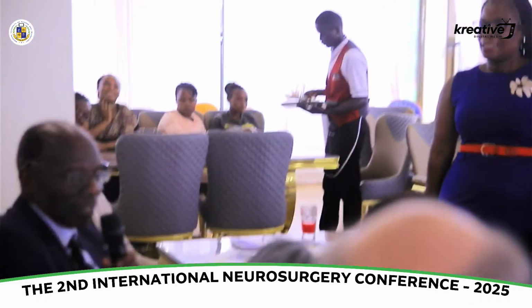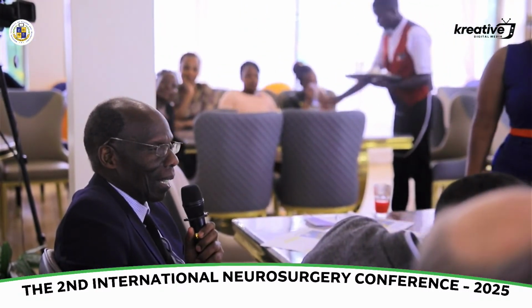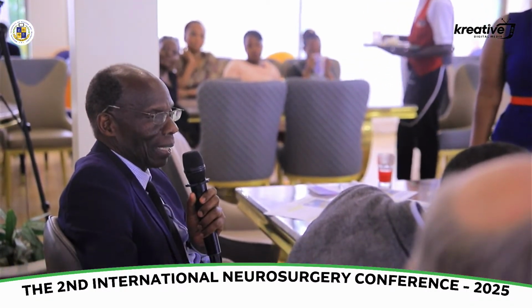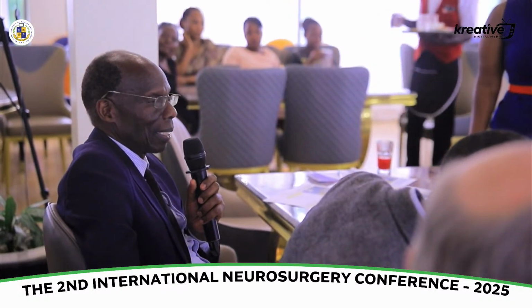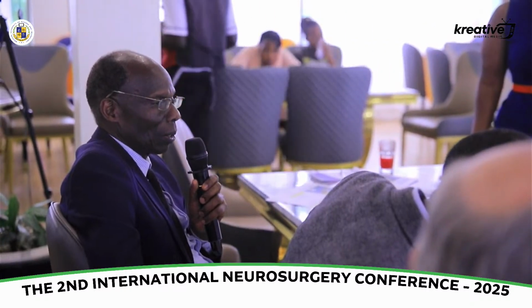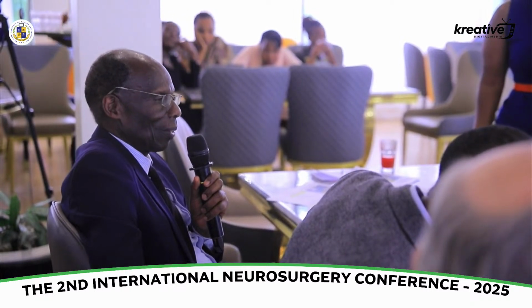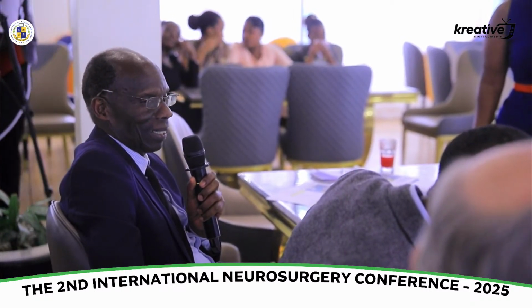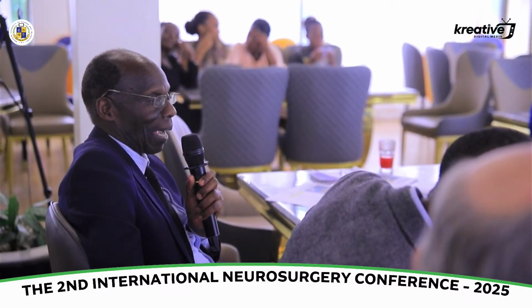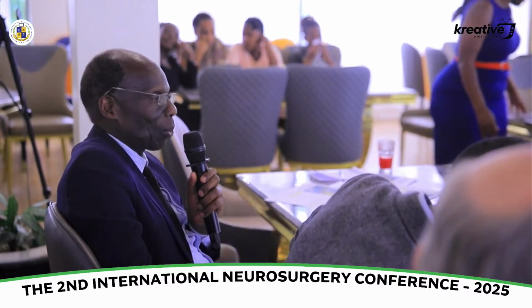Thank you very much for this demonstration. I'm just wondering whether color of skin can affect the results. Why am I asking this? Because we are running a study on infrascanner and intracranial injuries, and we have found that actually the color of skin had an influence in the findings. I don't know whether the color of skin can have a problem in this one.